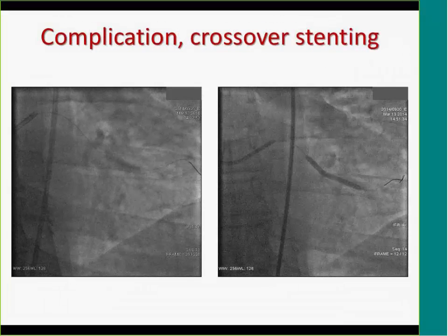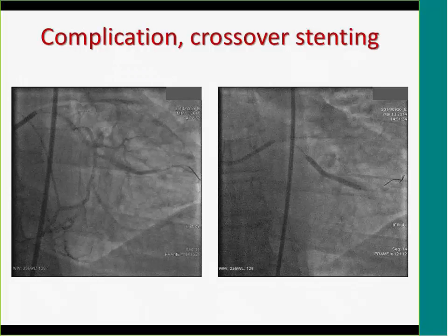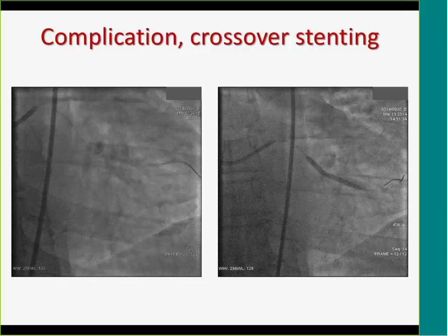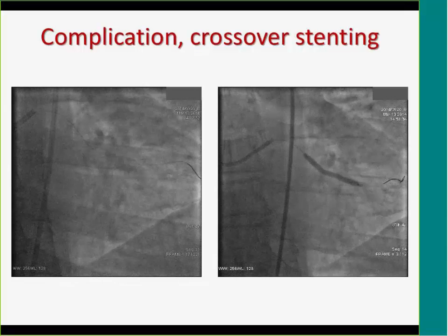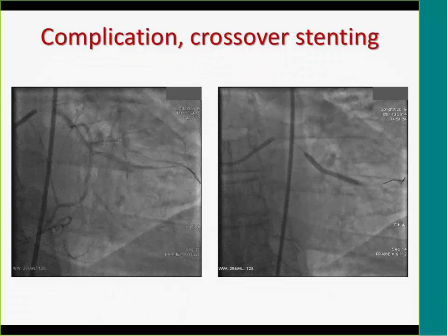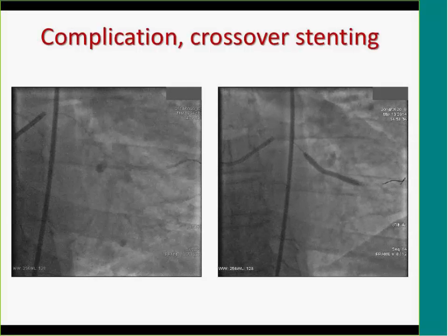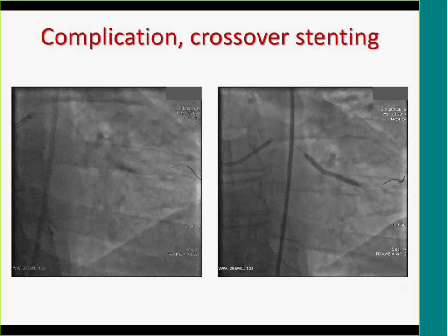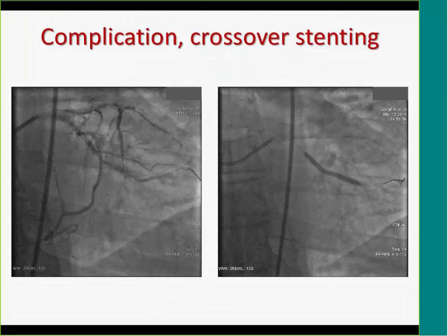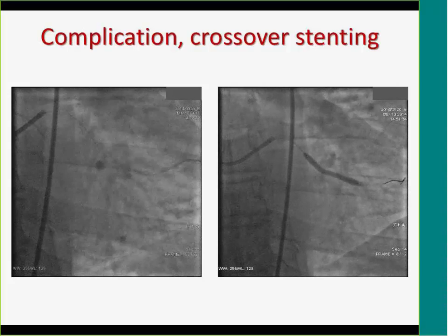The next phase was the complication. This repeated jump into the marginal branch with the tapered stiff wire created an occlusive dissection of the obtuse marginal branch, which was a really desperate situation because this gentleman has a diseased LAD with a distal occlusion of the LAD, and a non-dominant right coronary. The best and the most important branch was probably this marginal, but we occluded it.